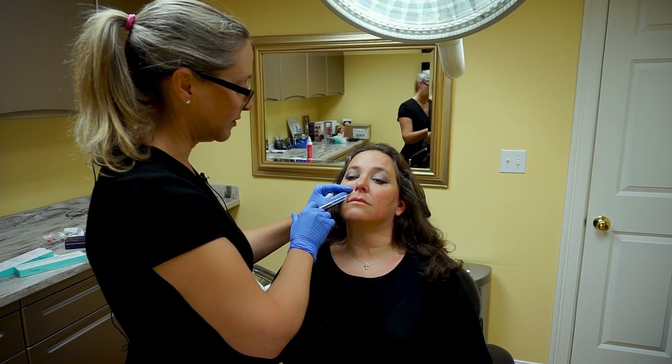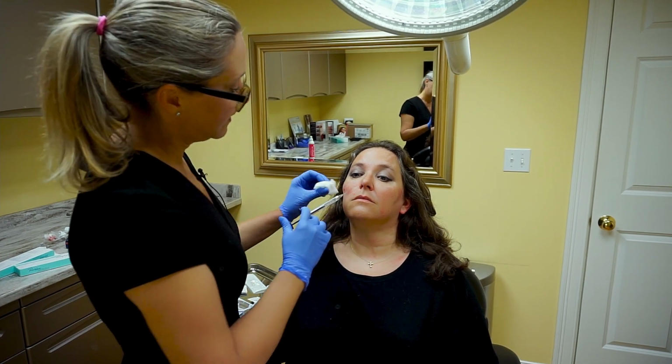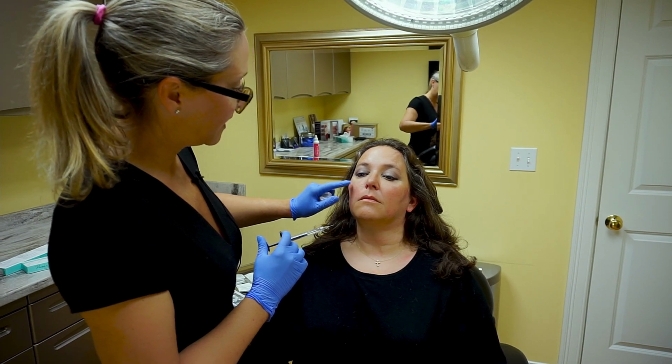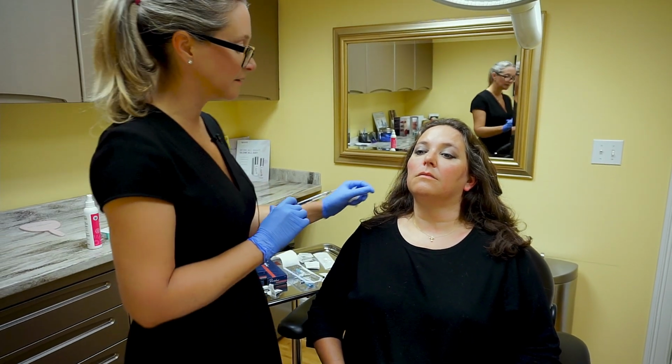You have to be really careful injecting into this area because you can embolize the vessel there and get some skin necrosis, so you don't want to inject fast there, but it really is imperative to inject in that area, otherwise it looks like you haven't corrected the fold well.